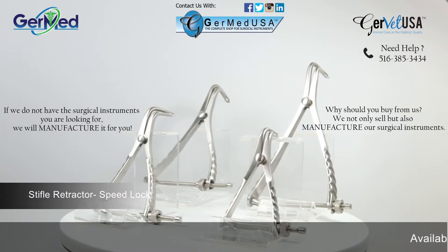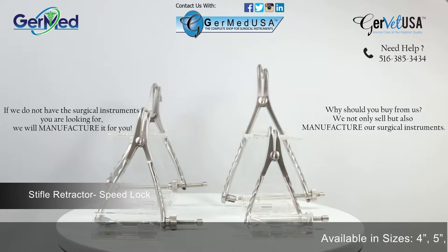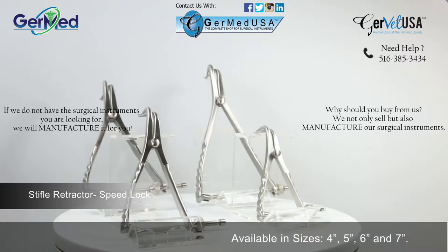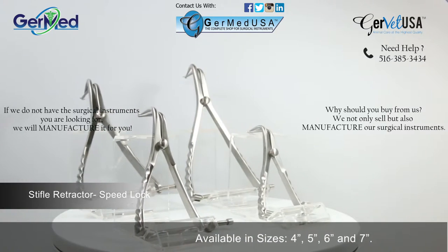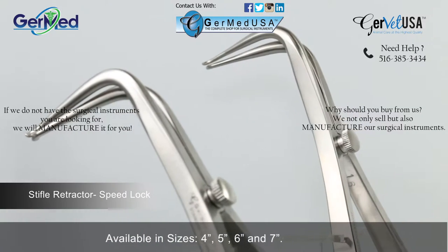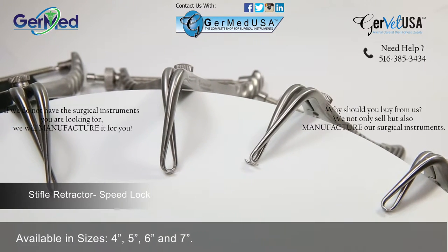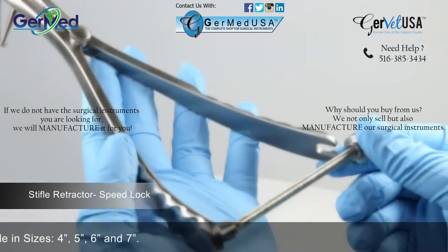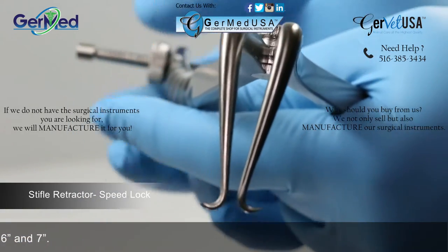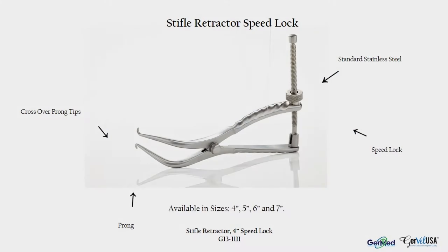GermEd provides the SpeedLock Stifle retractor in a variety of lengths in order to correlate with the size of the patient. SpeedLock Stifle retractors are a ratcheted instrument used in order to open the stifle. The SpeedLocking mechanism allows the retractor to remain in place and does not require someone to hold it during the procedure. It allows more control as well. The SpeedLock Stifle retractor is available in sizes 4, 5, 6, and 7 inches.